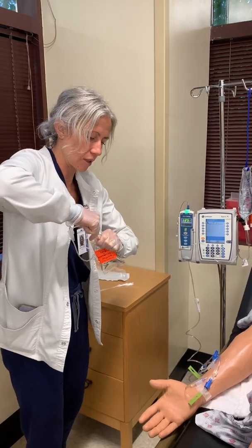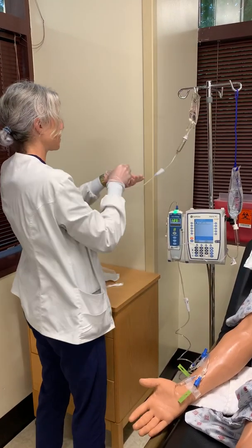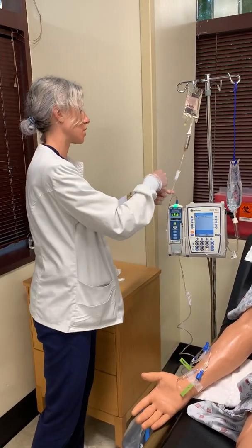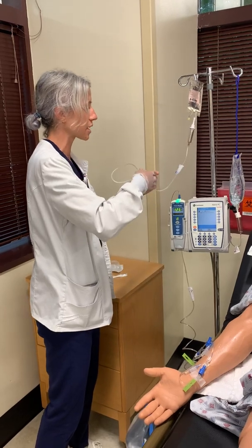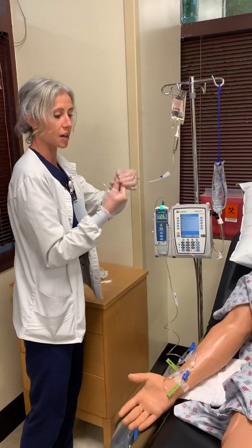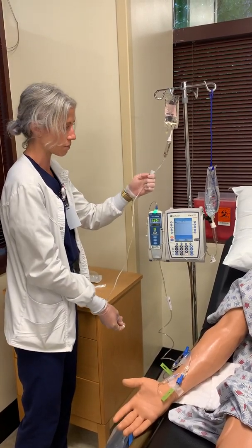You gotta really make sure that that's all the way in, okay? And then I'm gonna hang mine, okay? And then once again, we've had that locked, so I'm gonna move my trash can nice and close, okay? And these little secondaries are shorter tubing, okay? So I'm gonna make sure that I've got my cap off, okay? And we're gonna open that line up.